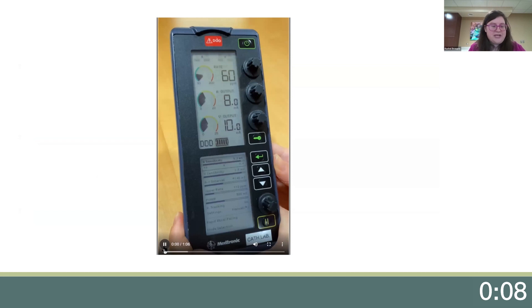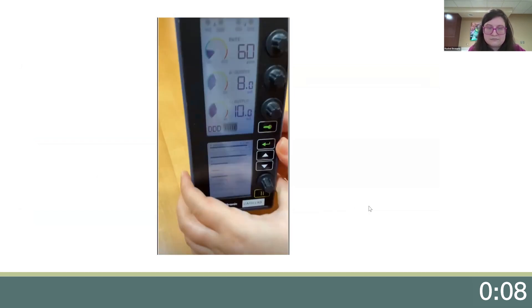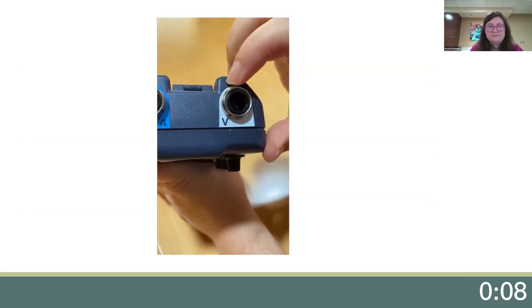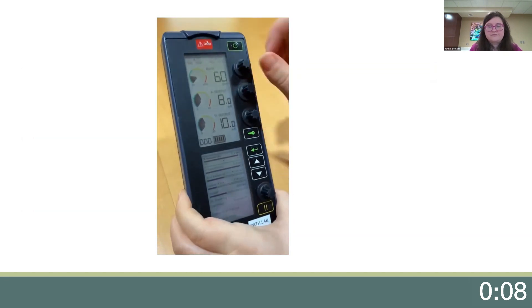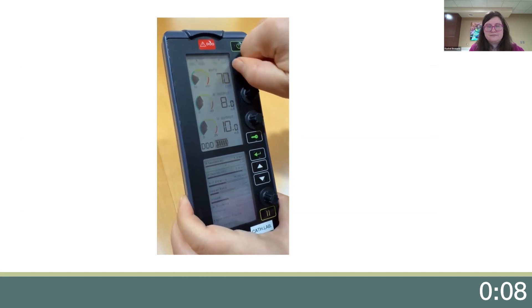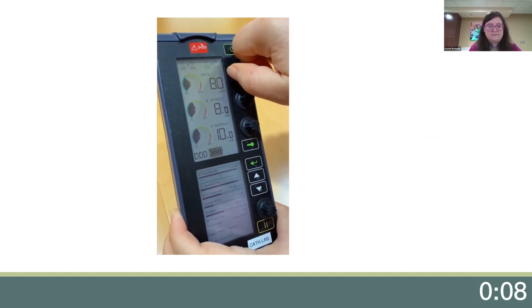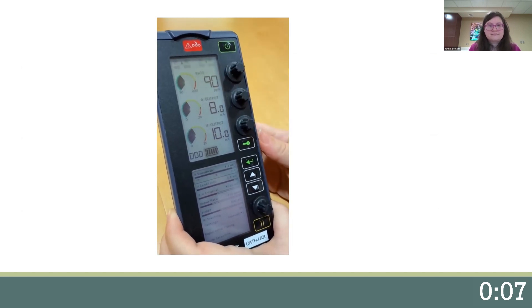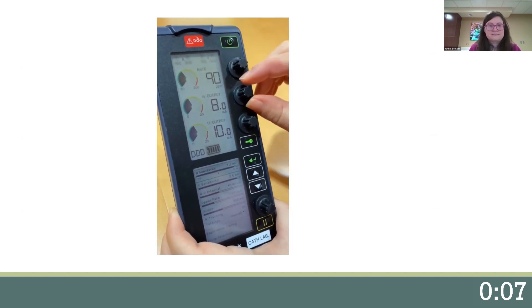Now that we have a patient before us, we can use pacing for their benefit. We must first understand how to use the pacing box, program its settings, and this video will provide a brief overview of how this can be done. This is one of the most common pacer boxes. You start by putting your A and V leads into the correct slots. I'm setting the rate to higher than the patient's intrinsic rate. I want to make sure that I see pacing spikes and a correlating arterial deflection on the arterial line.